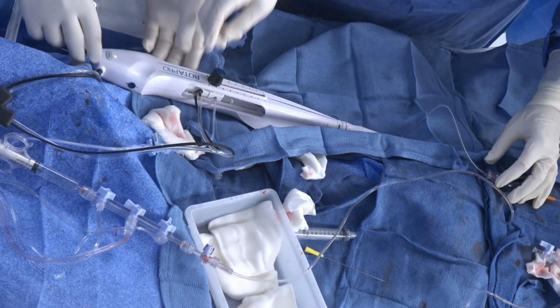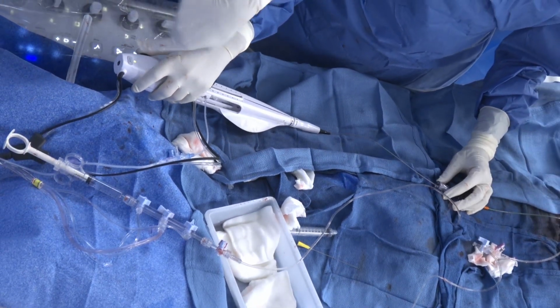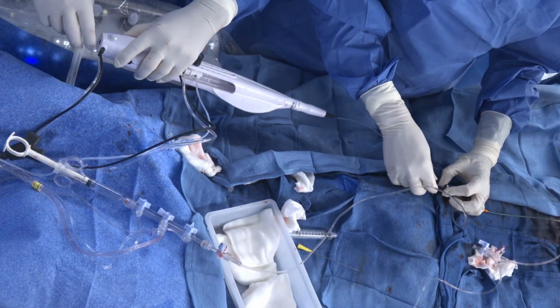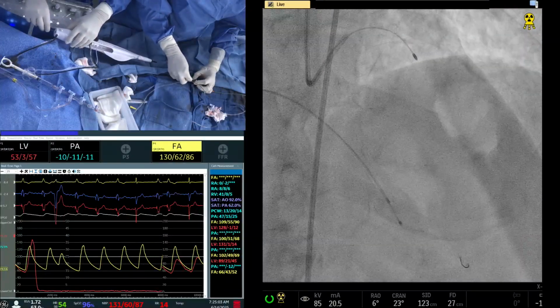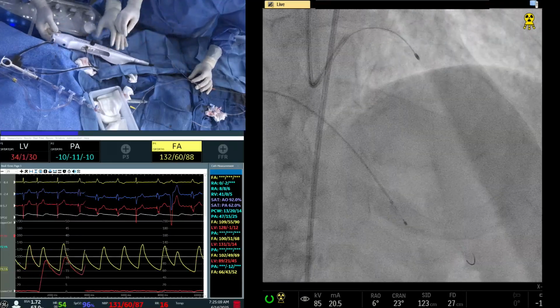And then what you're going to do is your brake release. You press brake release right now, and hold the wire. When you do brake release, the wire is free. And now press the Dyna. That's closer, good. Okay, we can stop now.